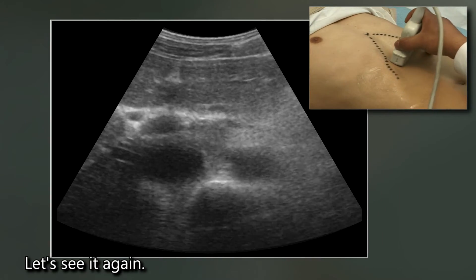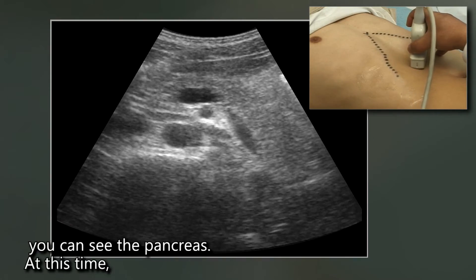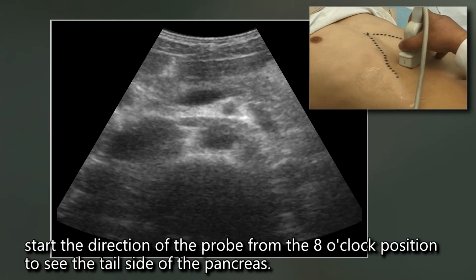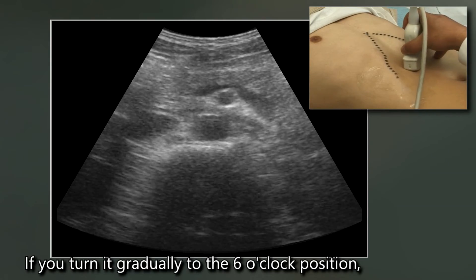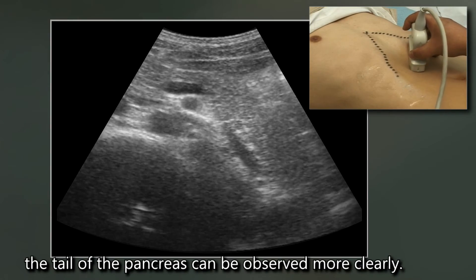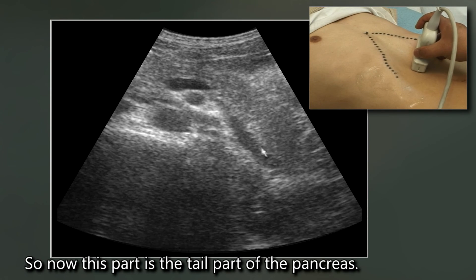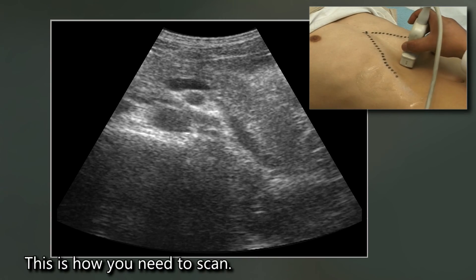Let's see it again. If you stick out your stomach a little, you can see the pancreas. At this time, start the probe direction from the 8 o'clock position. To see the tail side of the pancreas, if you turn it gradually to the 6 o'clock position, the tail of the pancreas can be observed more clearly. This part now is the tail of the pancreas, and the splenic vein is well observed. This is how you need to scan.